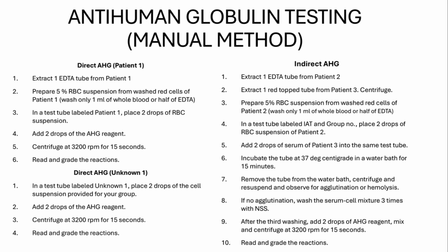Well, the color of your AHG reagent is green. So it's a combination of patent blue and tartrazine yellow. Or you can just answer tartrazine and then patent blue. So those are the dyes responsible for the green color of your AHG reagent. I just wanted to mention it. Sorry for injecting it in the procedure.